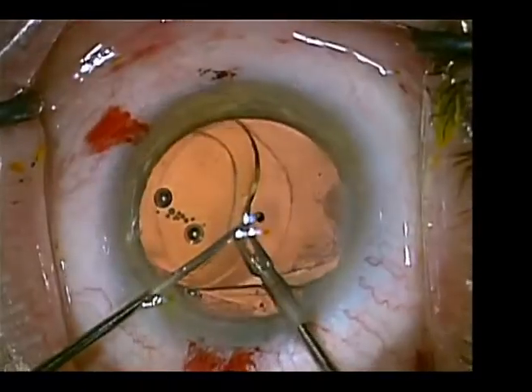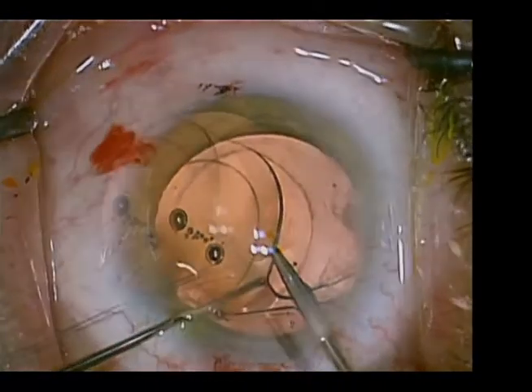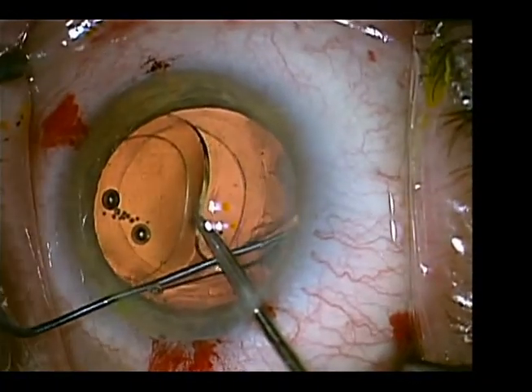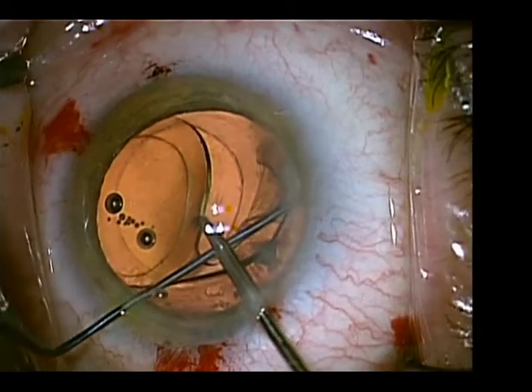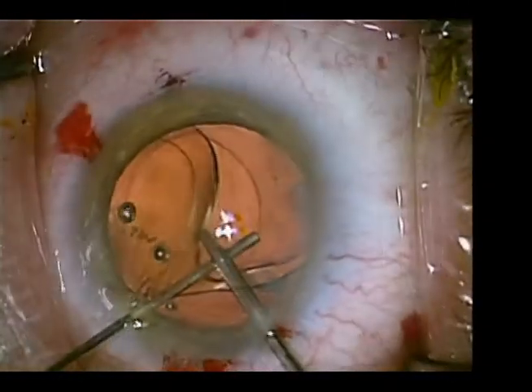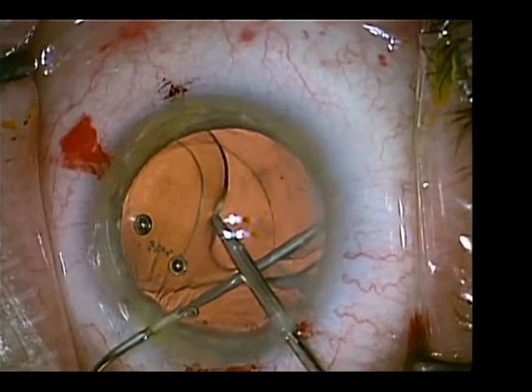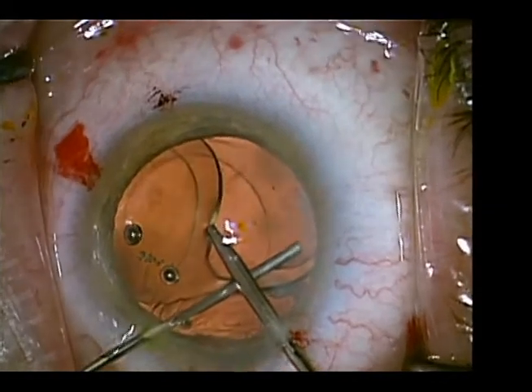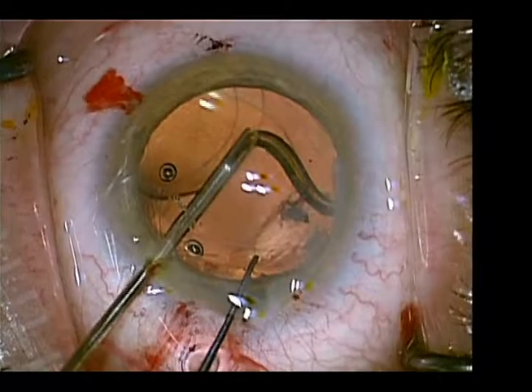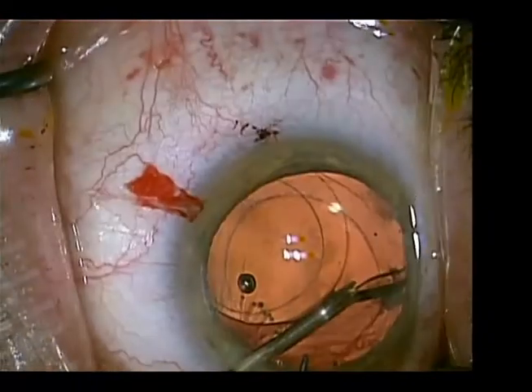Using a Szynski hook, one edge of the optic is elevated and then grasped with micro forceps in order to free the inferior haptic of the single-piece multifocal acrylic lens.